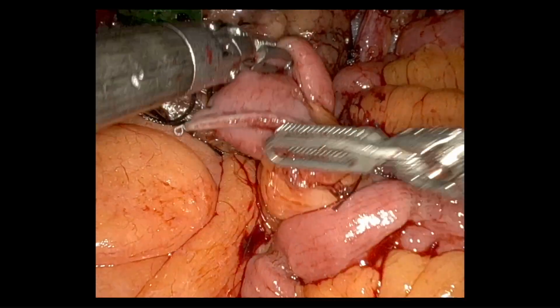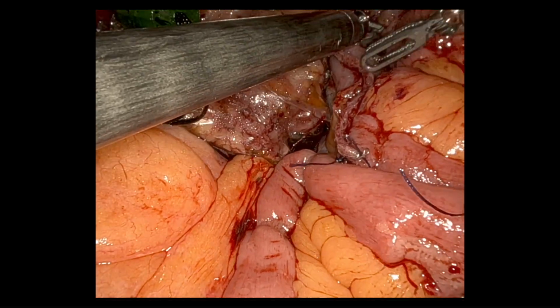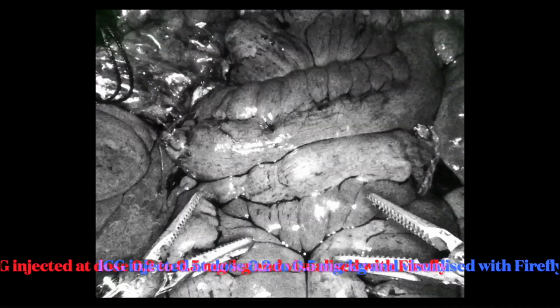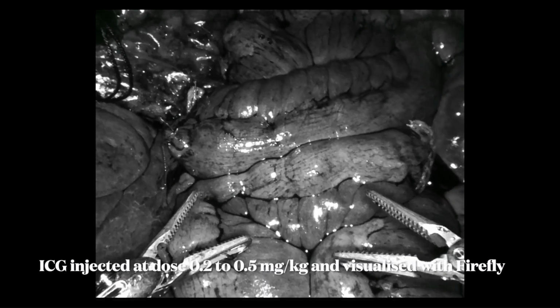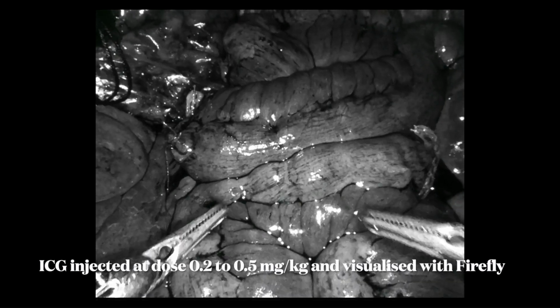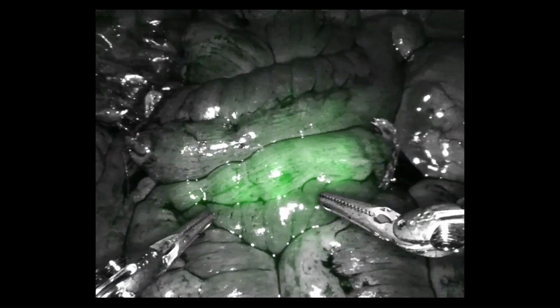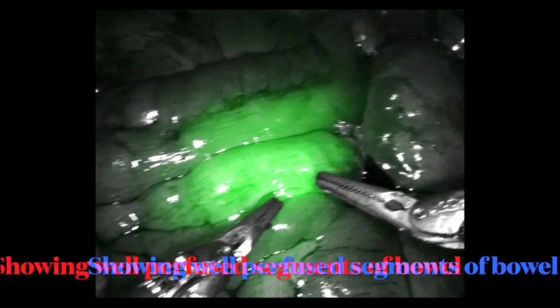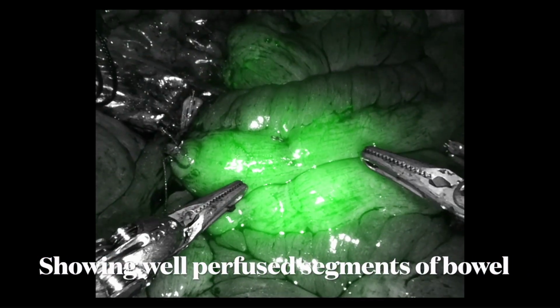We inject ICG at a dose of 0.2 to 0.5 mg per kg intravenously, and using the Firefly technique, we observe the perfusion of the bowel segment. In this case, the bowel segment seems to be well perfused all the way to the stapler line at the divided ends.